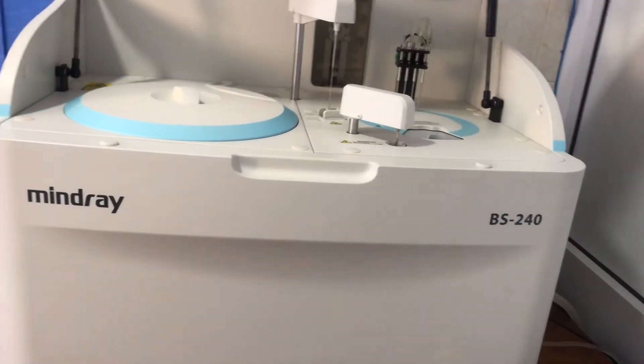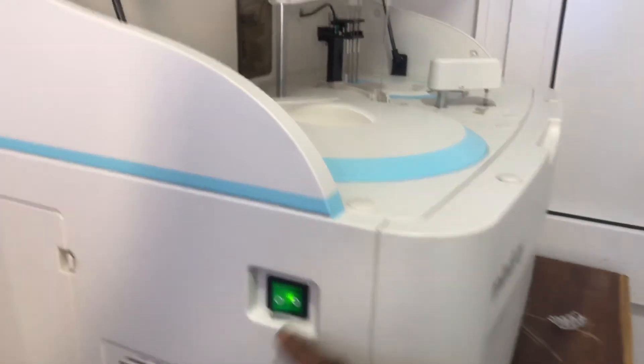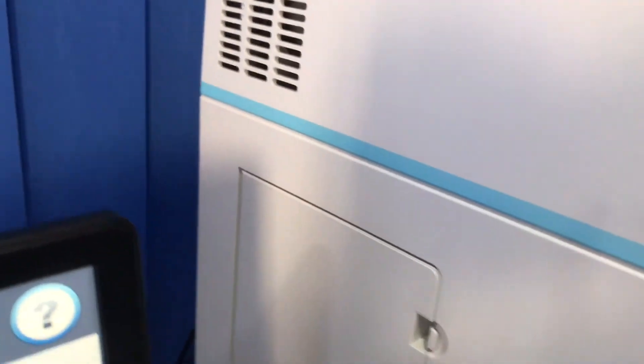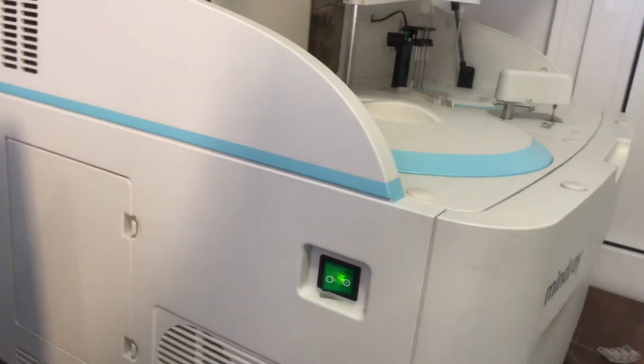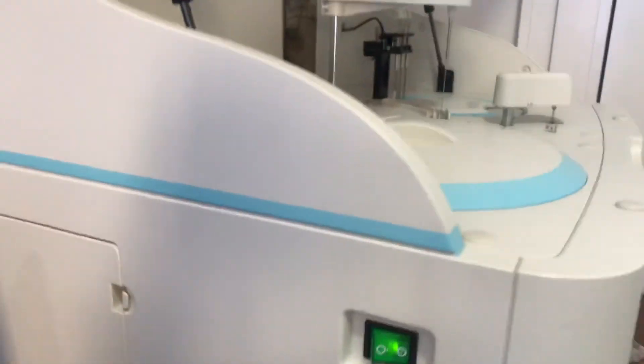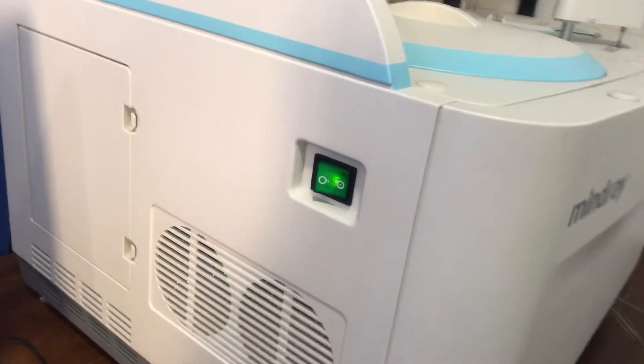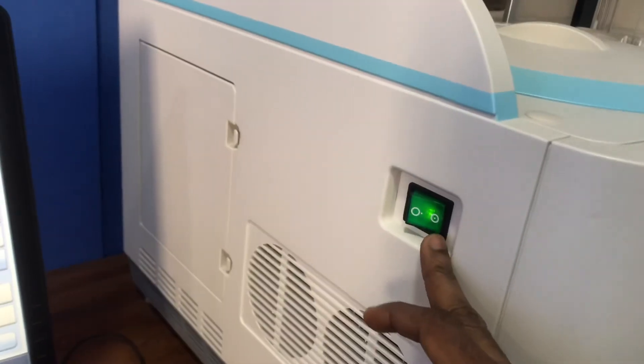If you look at the left side, we have the switch button here, and then the back side has the button for the refrigerator. If you want to put it on, you put on the refrigerator button first and then you come and switch on the analyzer button which is here.